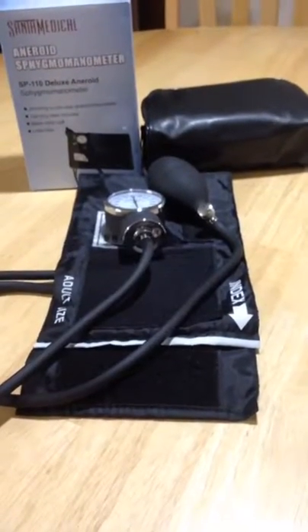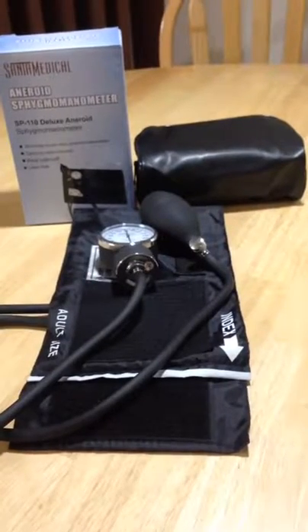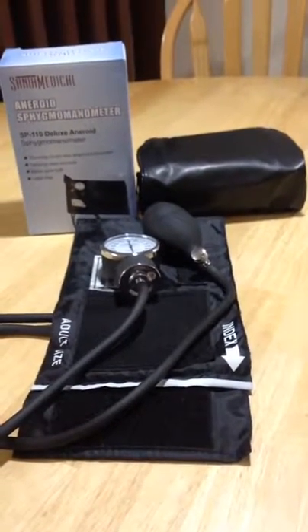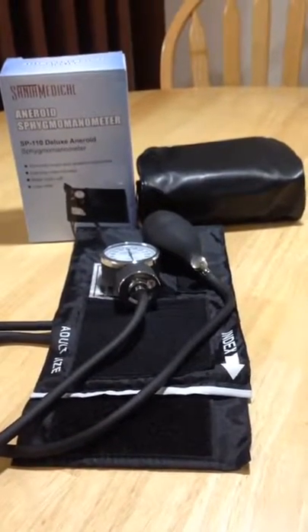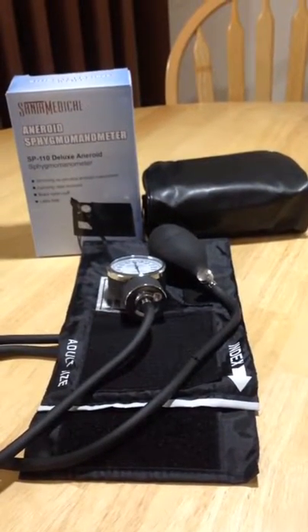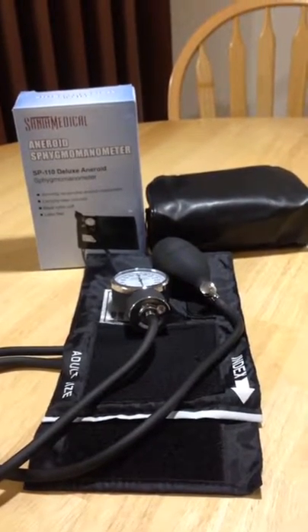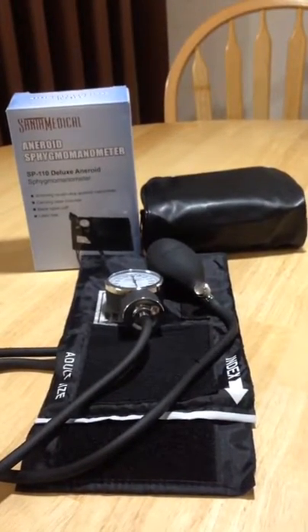Hey everybody, this is Anthony here and today I'm reviewing this blood pressure cuff and pump from Santa Medical. I received this product for free or at a heavily reduced price for my honest and unbiased opinion — and you guys know with me, that's exactly what you get. Questions or comments, feel free to leave them and I will respond. If you do like this, let's like it, share it, and get the word out on these guys.